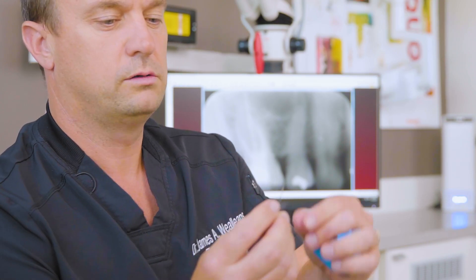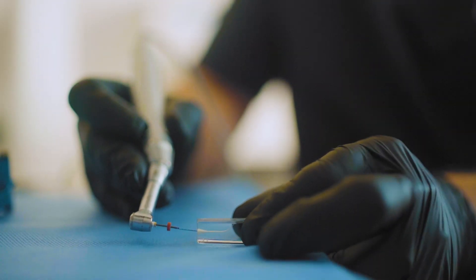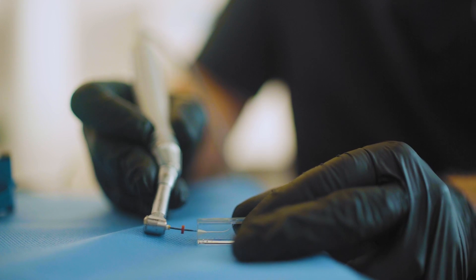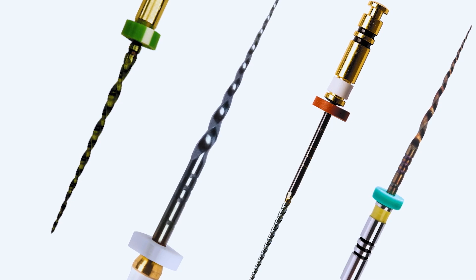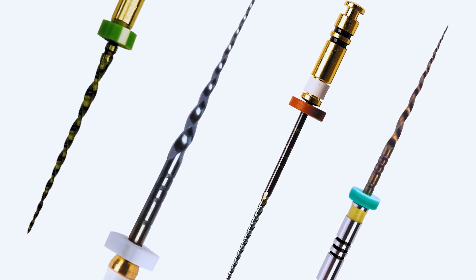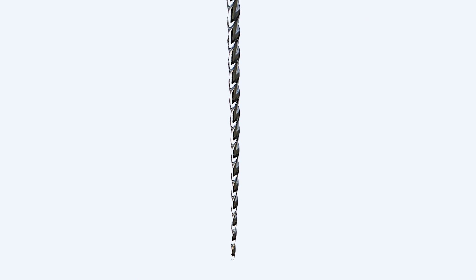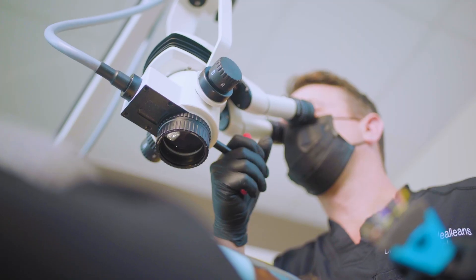The nice thing about the Edge file is it's extremely soft and ductile. You can grab the file and bend it in multiple directions, and it stays in that shape. It's so soft that the dentin, the canal, can dictate where that file goes. We can go around curves as high as 90 degrees. This file system can instrument significant curvatures, be very predictable, and avoid the stress of breaking or going through many different files — which I love about that system.